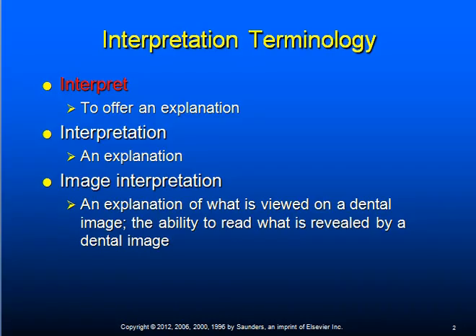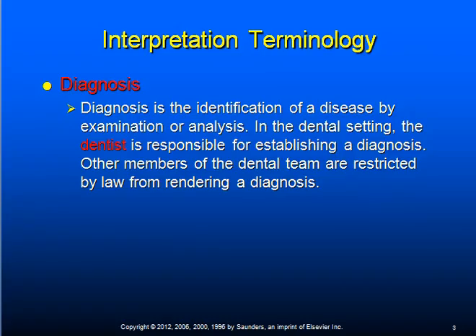To interpret means to offer an explanation. The interpretation is an explanation. When we are discussing image interpretation, we are talking about an explanation of what is viewed on a dental image, the ability to read what is revealed by a dental image.